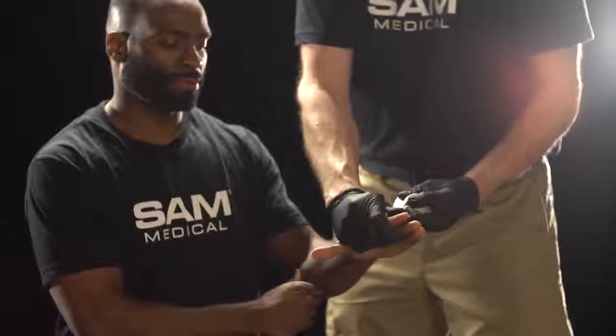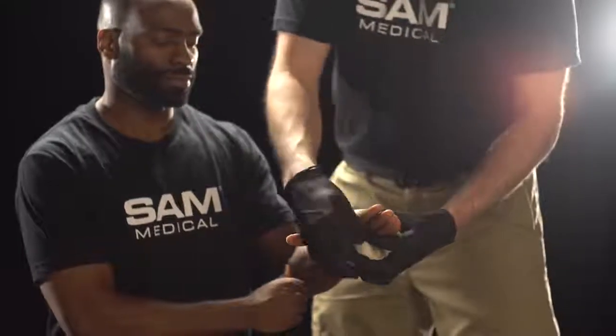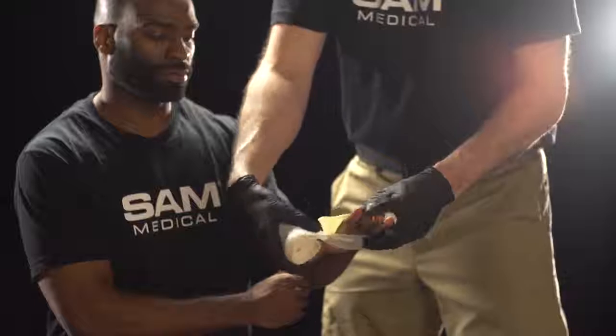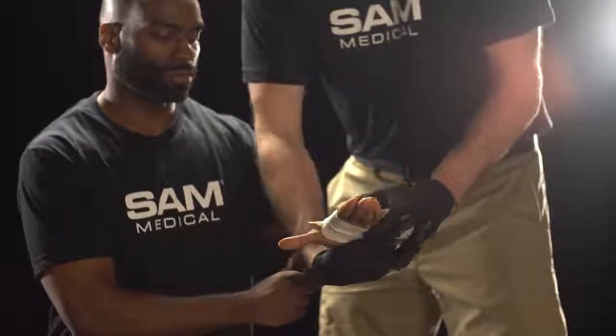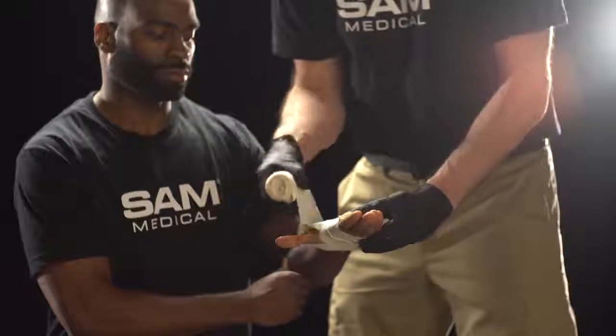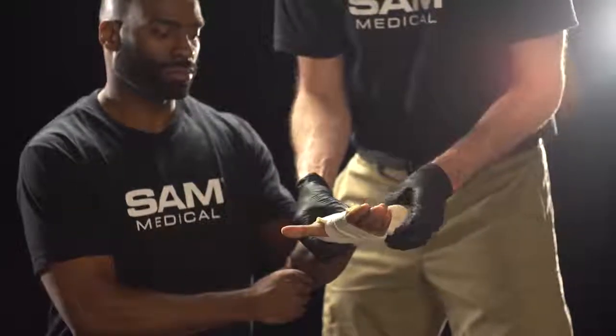If after 3 minutes the bleeding has stopped, apply a pressure dressing over the wound. If bleeding has not stopped, additional measures such as pressure points, elevation, or the Sam XT tourniquet may be needed.